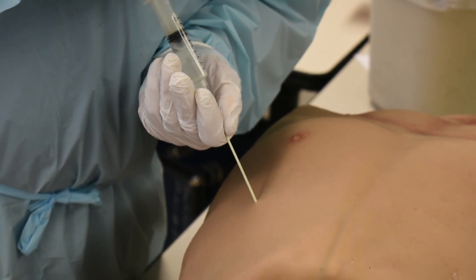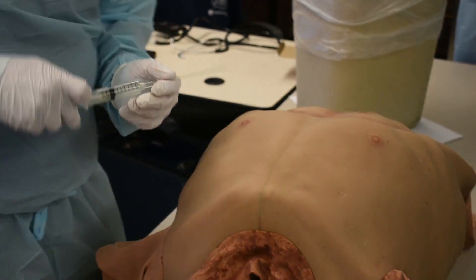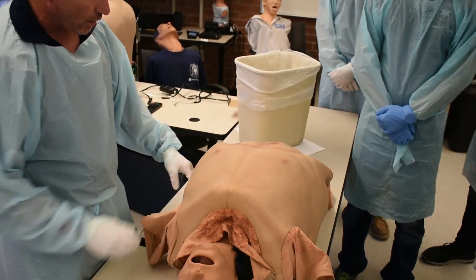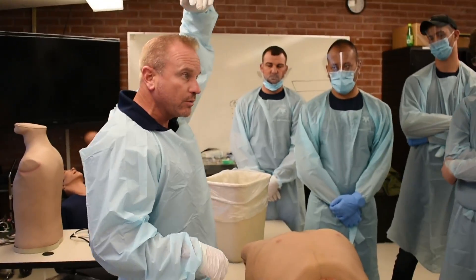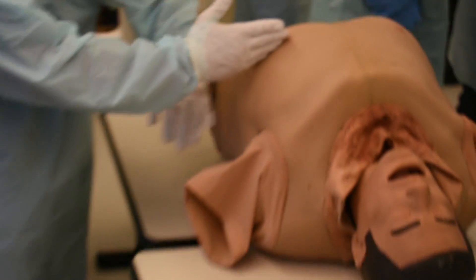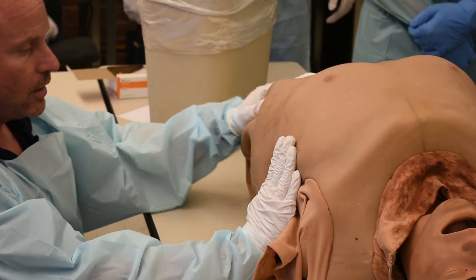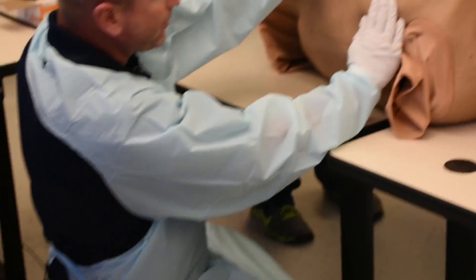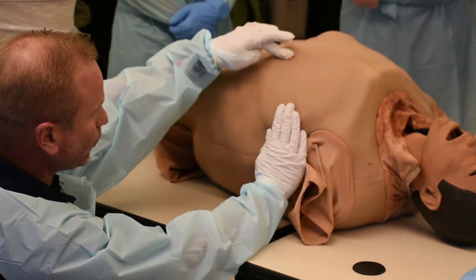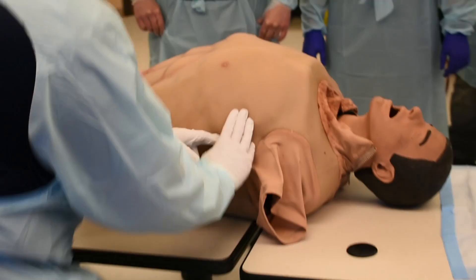I would never want to angle down. What structure could you hit, especially on the left? The heart. Fourth or fifth intercostal space — for you guys that have that option — this is where we go in combat. We just flip the arm up over the patient's head, just like when we do chest tubes, and that's going to open up that rib space. The nipple line is literally T4. You can also put your gloved hand in the axilla — my thumb happens to be right on rib four. We're going in fourth or fifth intercostal space. You have two spots to do it.